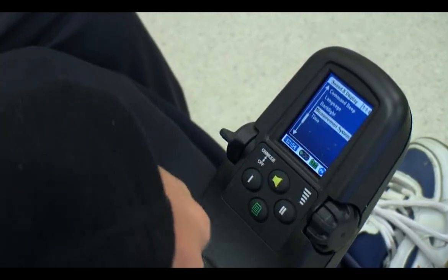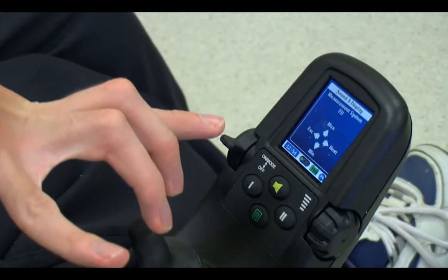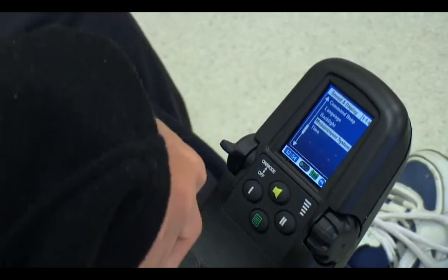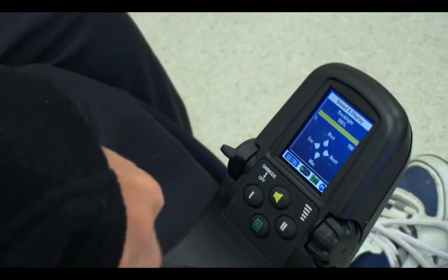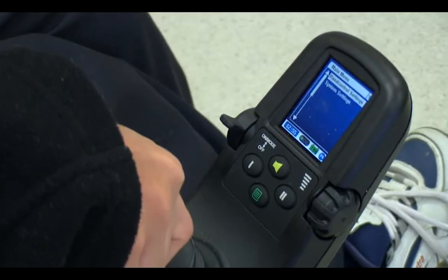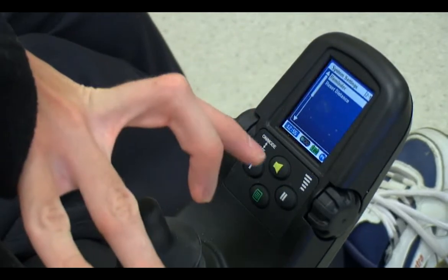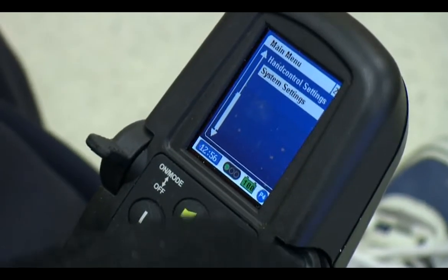We can go into here and set the — I've got no idea what that does. We can set the backlight; if I go in here I can turn down the light or turn it back up. And then if I go in here I can set the odometer or I can reverse it. To get out of that you can push any of the buttons.